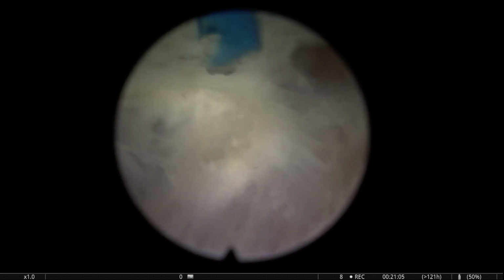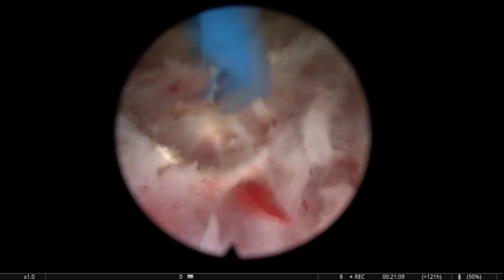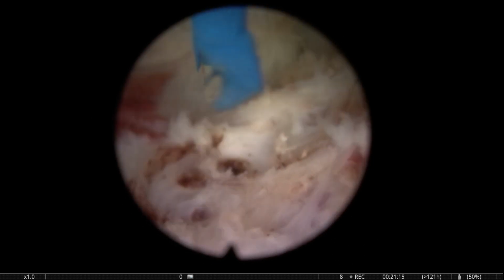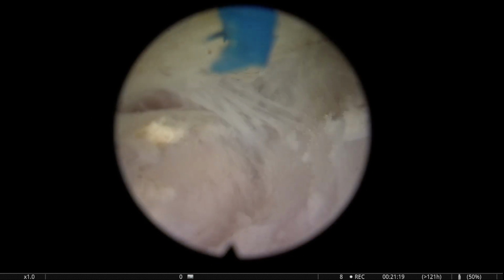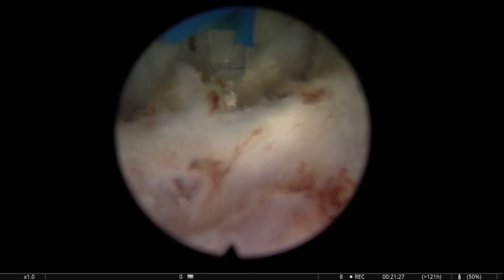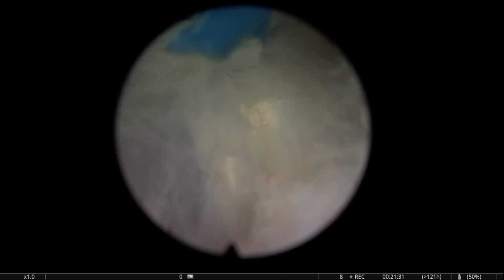And there we are, you see, coming around the adenoma. Again, that's a nodule. You see that? Many times you can see that's a nodule. You see this line that goes around it. You see the color. So sometimes we had to dig a little bit deeper to try to remove these nodules.